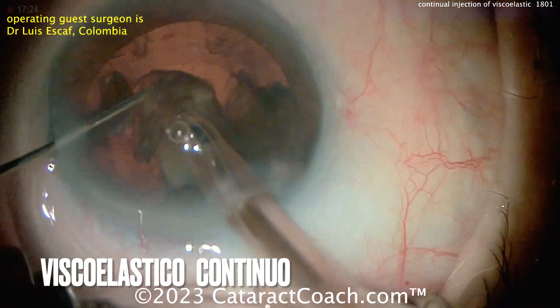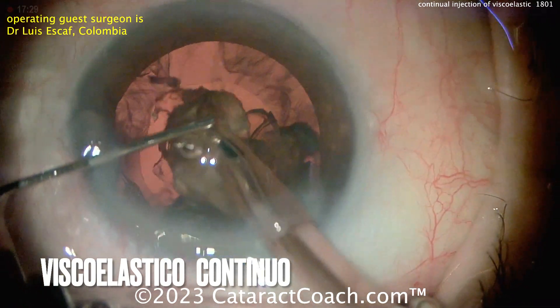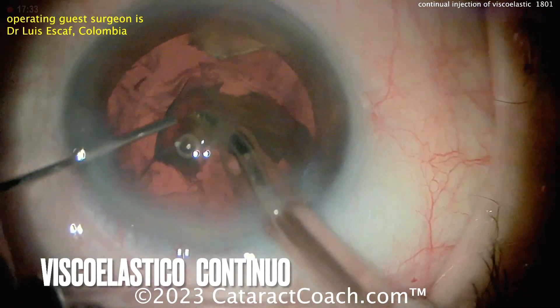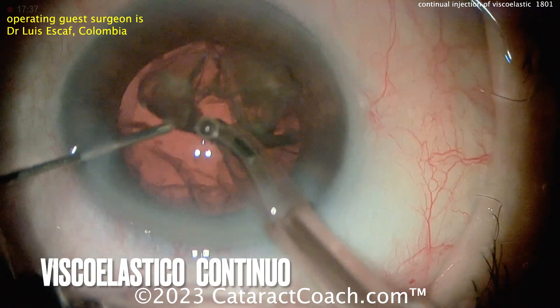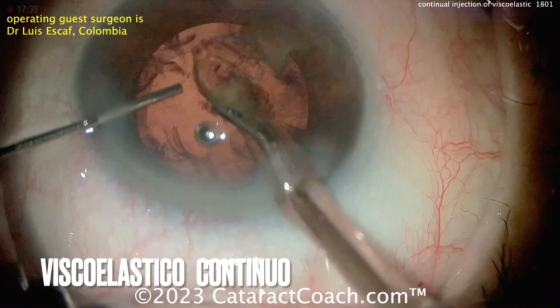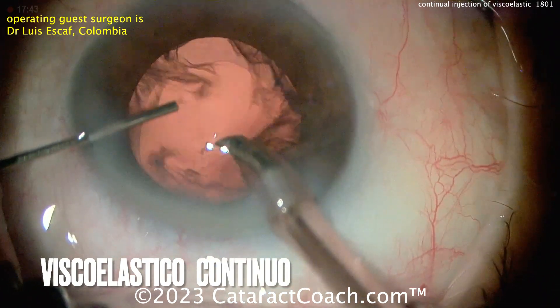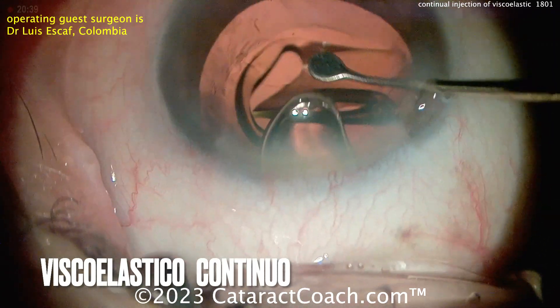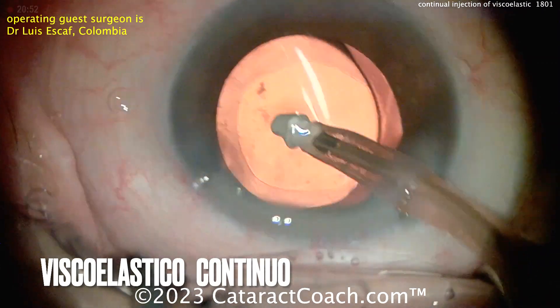I wanted to show you this video because I just thought it was an interesting idea — not something that I've tried on a routine basis to inject it continuously, but it's something I may want to consider for future cases. So here at the end, remember this is the part you've got to be very careful. You don't want surge. Nice and easy. Slow down your parameters. Take the last pieces down nicely. Good chamber stability. Looking good — end of the case. Here comes the lens going in the capsular bag. The patient's going to be thrilled. What a beautiful outcome for this patient.